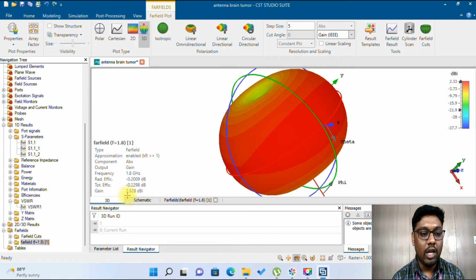Gain is also in the range of 2.3, which is an acceptable range, because gain should not go negative. So here we are getting an acceptable range, since the material is FR4, the maximum range is up to 4 or 5 dBi. So we are getting a minimal amount of gain and directivity, which is acceptable.